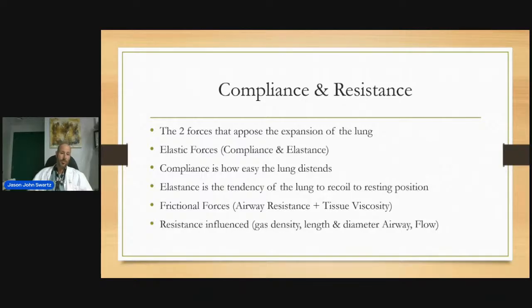Looking as well, we have the frictional forces. We focus on the airway resistance, but just as a side note, there are also the frictional forces, the resistance due to the tissue viscosity of the lung itself. But we focus more on the resistance through the airways, and that's influenced by gas density, the length as well as the diameter of the airway. We're speaking about the artificial airway, the ET tube, as well as the conducting airways, all the way down to the tinier airways.